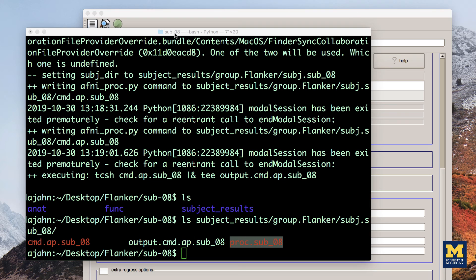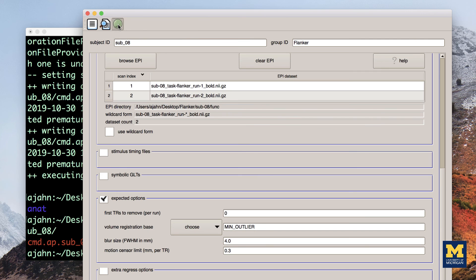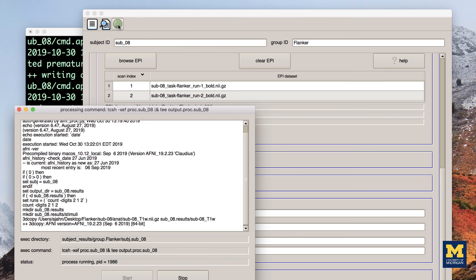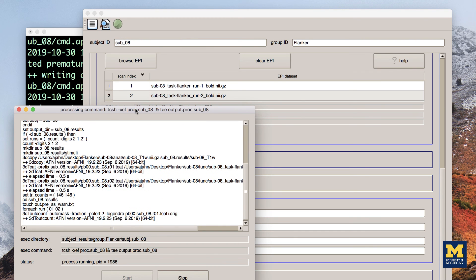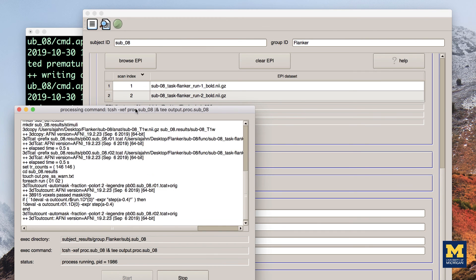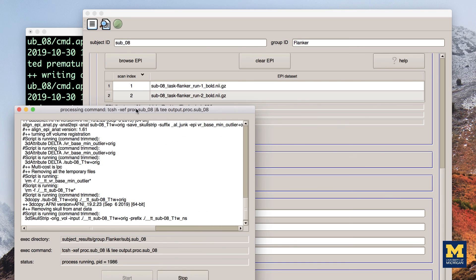We are now ready to run this script. You can either type the code that was listed in output dot cmd, or you can simply press the green icon button at the top of the Ubersubject dot PY GUI. If you do the latter, you will see another window open up that shows each command being run and its corresponding output.